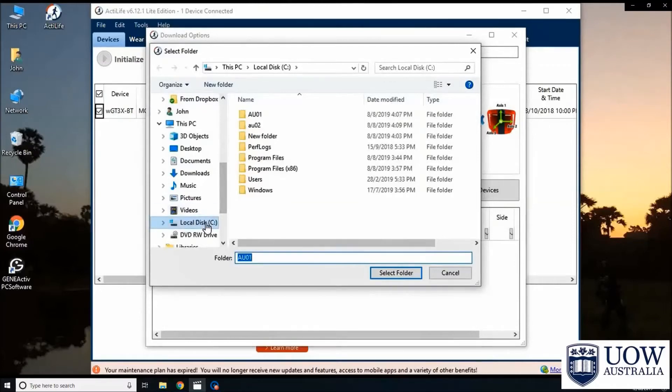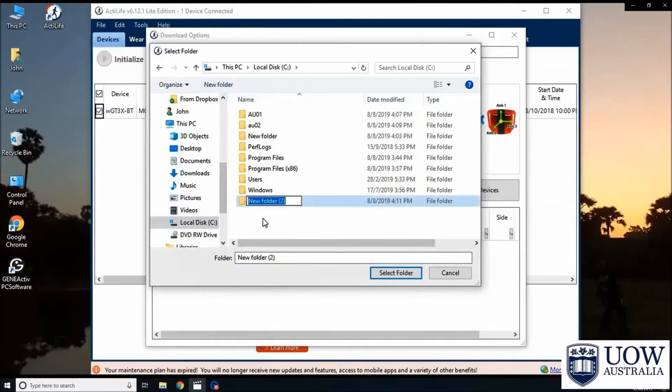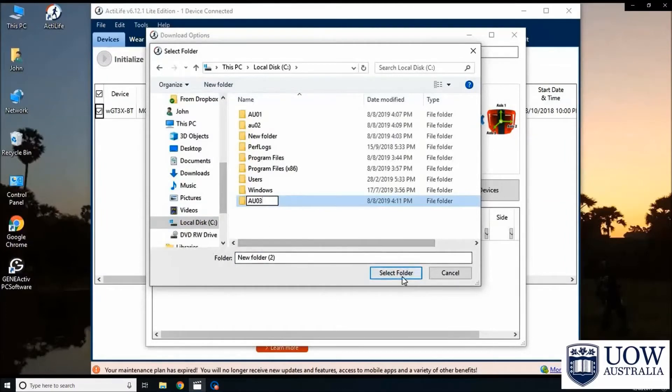To create a new folder, go to the local disk and click on the new folder option. Once this is done, select the corresponding folder and click OK.